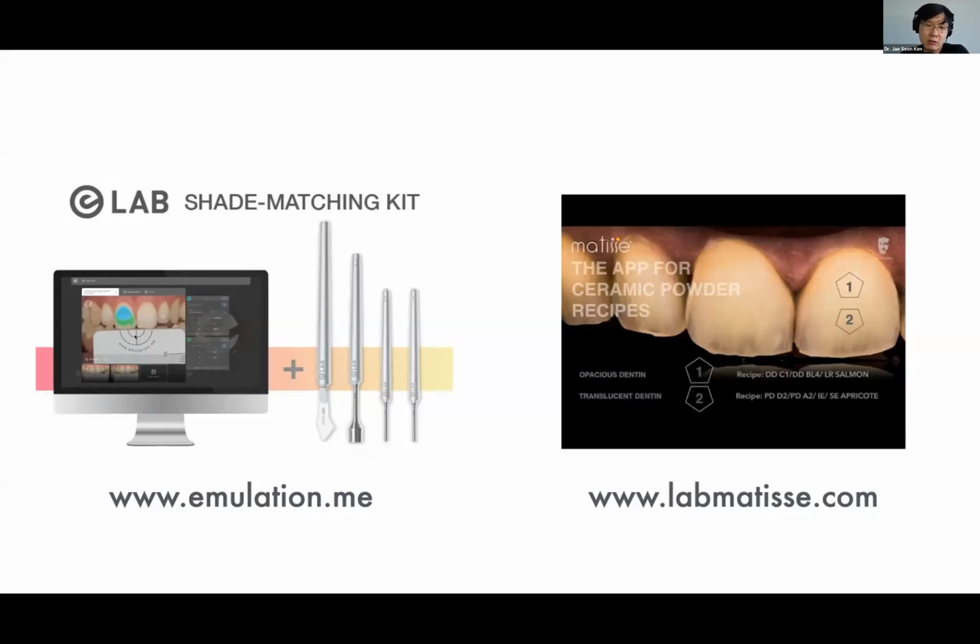So Ben always says, please take a picture of the shade guide with the gray card, because I want to see what the shade guide looks like in comparison to this. Because just following this recipe could be okay, but if something goes wrong, it could be disastrous. So just want to have a backup. So that's one of the ways. Just always listen to what your ceramist says and see what they want.